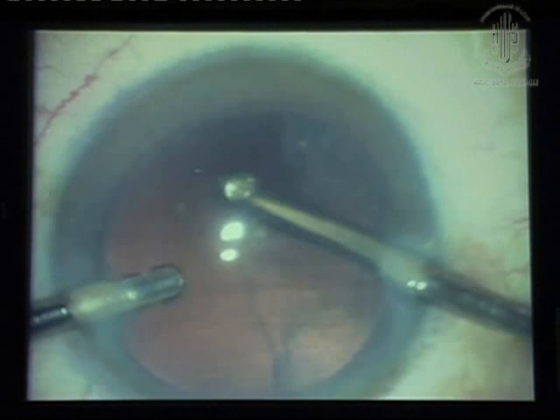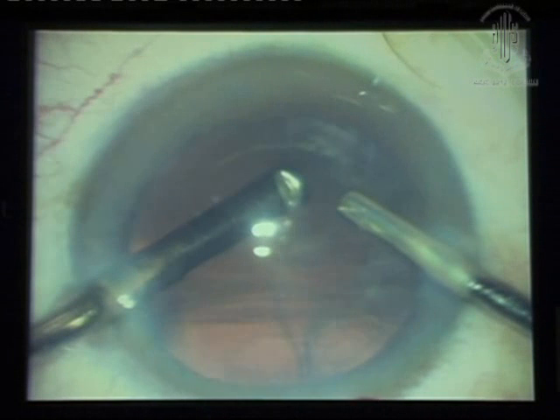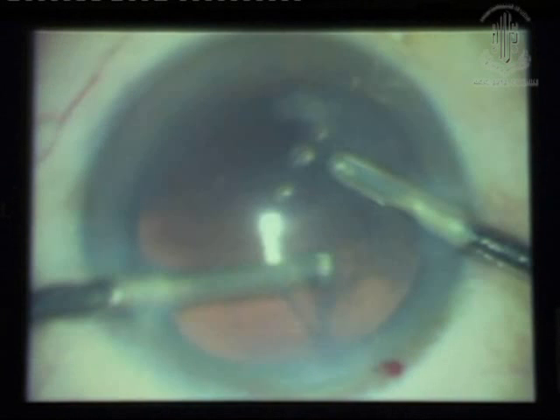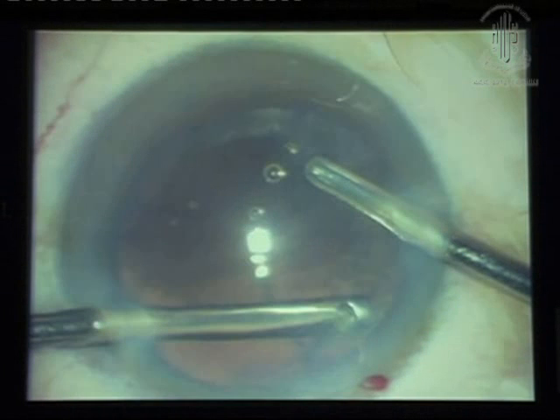This is behind the plane of the PC rent that I was doing the vitrectomy. Make sure that there is nothing at the plane of the PC rent, no vitreous.